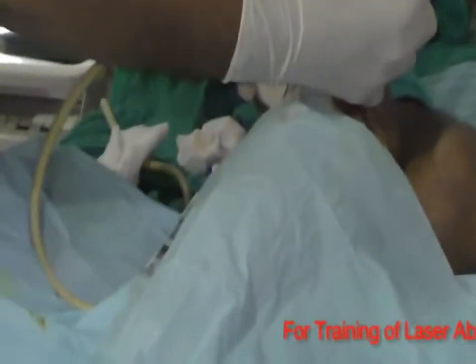After giving local anesthesia, what we do is we go in an in-plane approach.